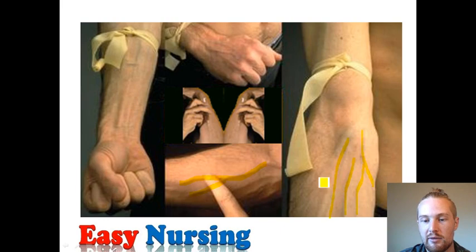These would be lovely to start, especially because you see how straight they are. Now, I told you to avoid bifurcation. So if I were to start an IV here, I would probably start somewhere around here, so that way by the time the IV goes in, it only comes to about right here. You don't want to start right at the start of a bifurcation.